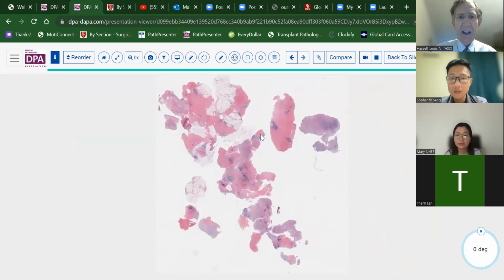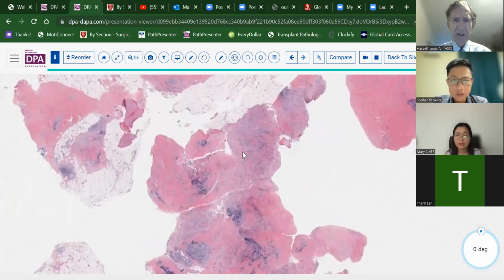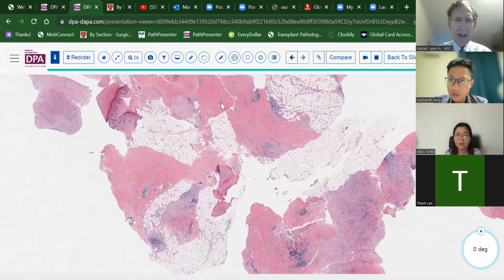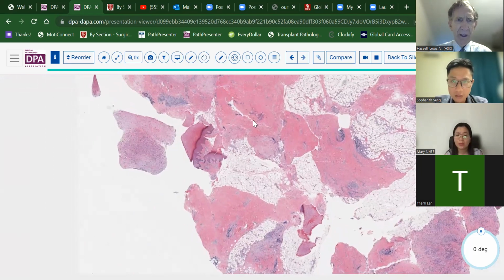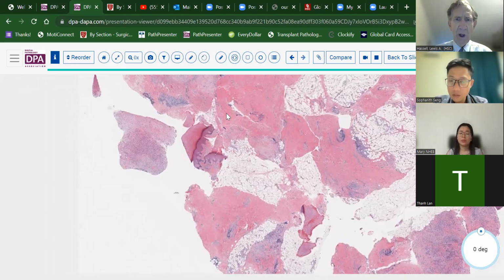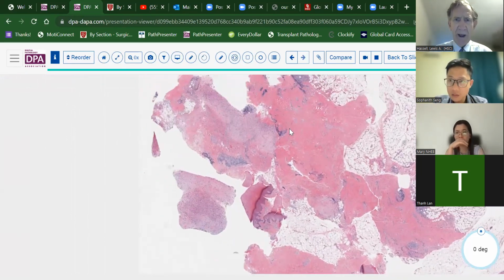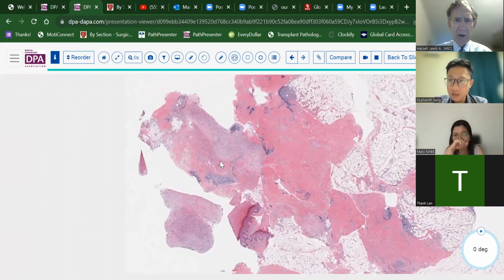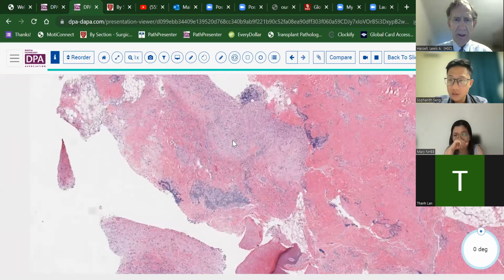So this last slide is again from a younger patient. And this is on a distal extremity on their arm, and sort of a subcutaneous mass that has been sort of persistent and sort of irritated, maybe a little bit painful, and not really well defined. As you can see, when they biopsied it or tried to remove it, they thought it might be a cyst or something, but it just sort of came out in chunks.